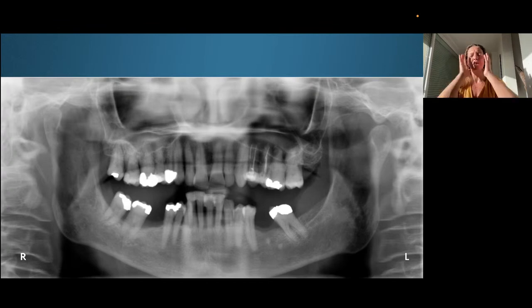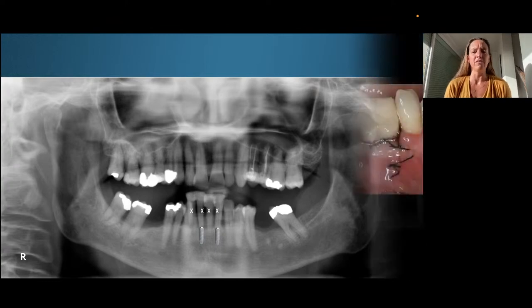So usually in the lower incisors, I usually place the implants in the lateral areas, or so that they have a gap of a tooth between them, because they are very thin, so we don't have a lot of space. And in this case, the best bone available was actually in the area of the 32 and the 41. So this is where I plan to place my implants.